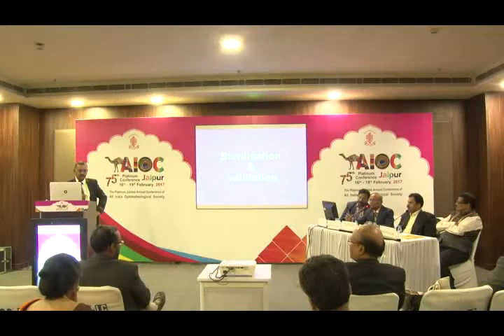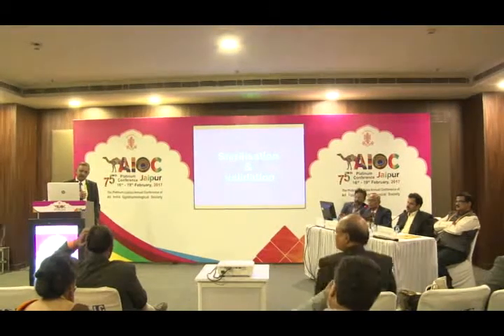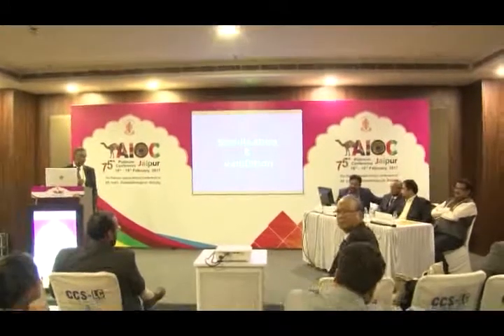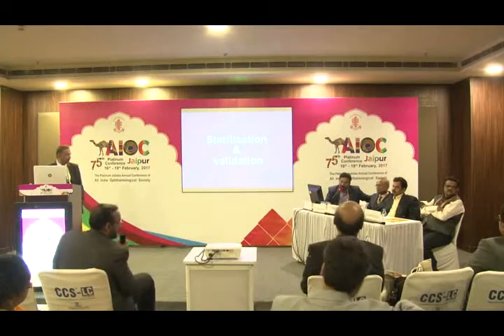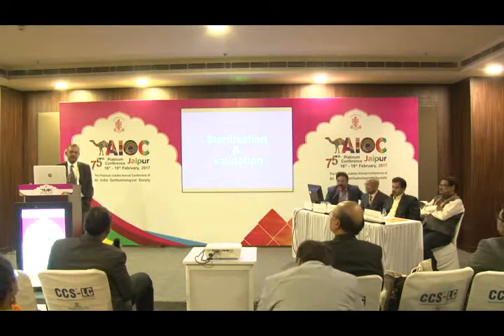Hot air oven will take a long time, and the temperature is very, very high. It will spoil your instruments. The tip of the instrument will be spoiled. Again, the hot air oven is not properly validated. The temperature mechanism is not validated. So that's why it's been given up. It's not being used at all in ophthalmology.